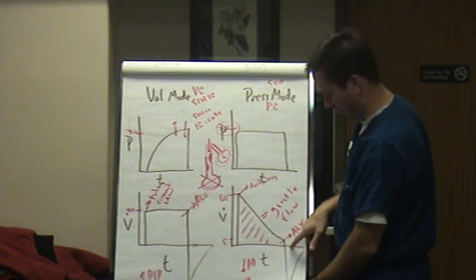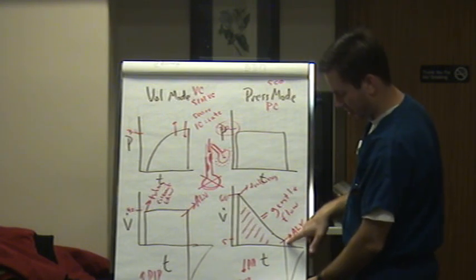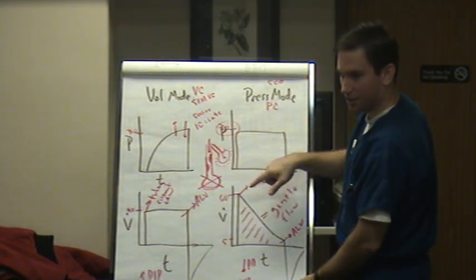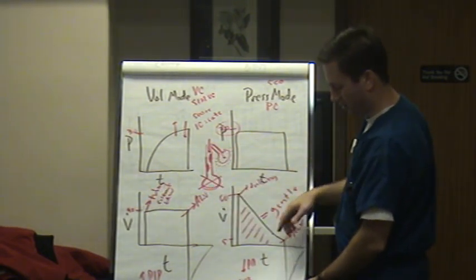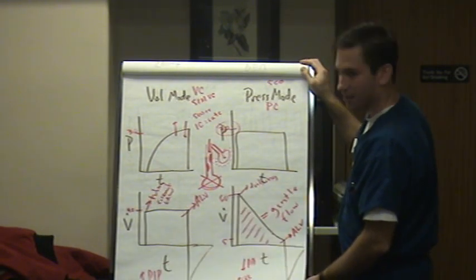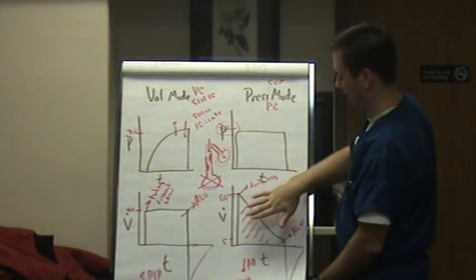And Dr. Simpkins, we just got through talking about how gentle this flow is, when it shoots in and decelerates down, at this slower flow is when you're down at the terminal airways. And so if you do have lesions and obstructions, this slower flow has a better chance of recruiting. And that's why your PIPs come down, because you have less flow in small airways in pressure control modes. That's a very nice explanation. And so that's the whole goal of pressure control, is that right there.